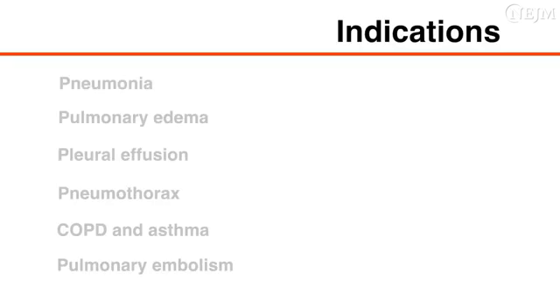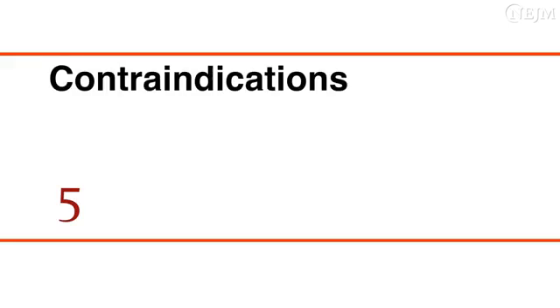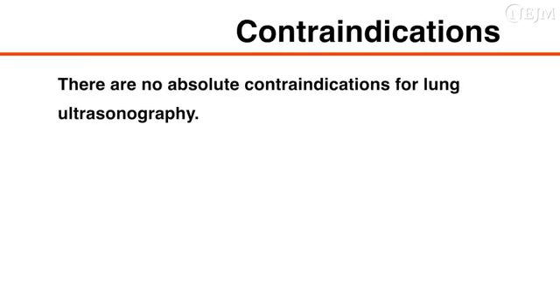Point-of-care ultrasonography of the lung is helpful in assessing patients who have dyspnea associated with pneumonia, pulmonary edema, pleural effusion, pneumothorax, chronic obstructive pulmonary disease or COPD and asthma, and pulmonary embolism. There are no absolute contraindications for lung ultrasonography.